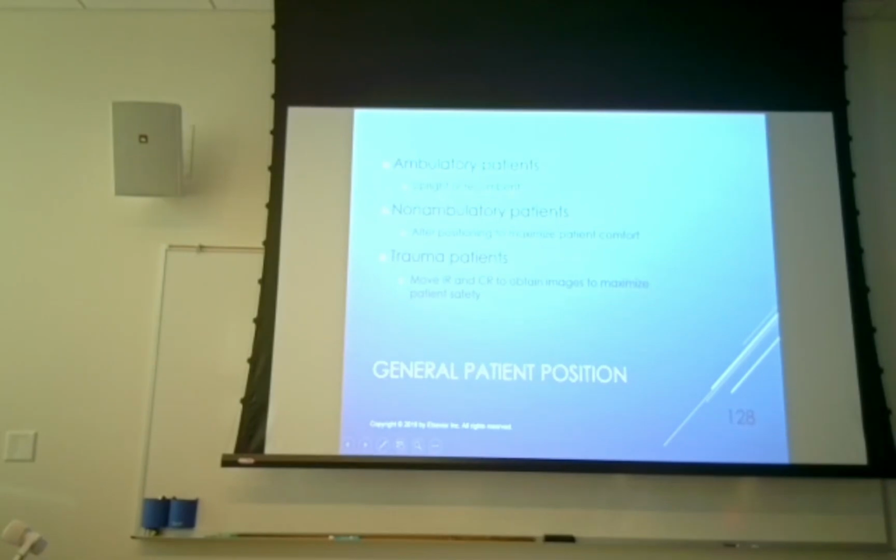In the gown, ambulatory patients, you can do upright. I kind of don't recommend upright. I've never had a whole lot of success with taking exams with the patient upright because the patient has a tendency to move, especially whenever we're doing a lateral. With a lateral T-spine, we're going to be doing a breathing technique. So the possibility the patient will be in motion throughout the exposure is pretty good. So, use your discretion. If you have good luck with upright, have at it.